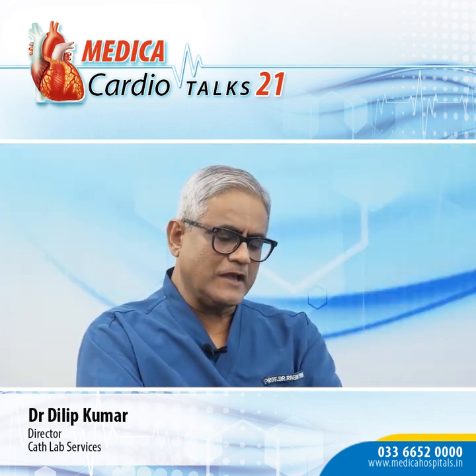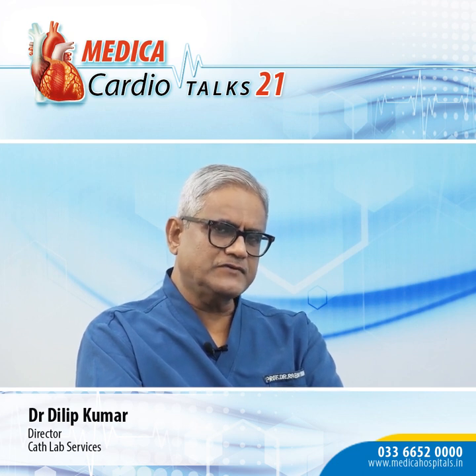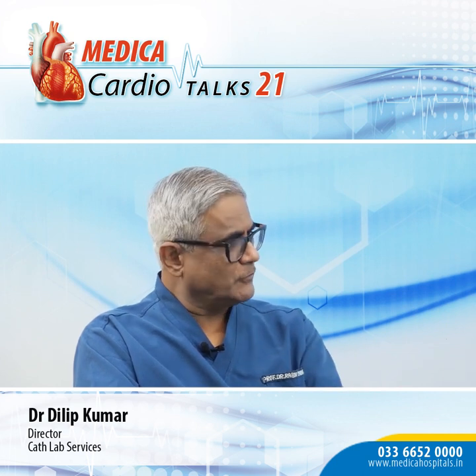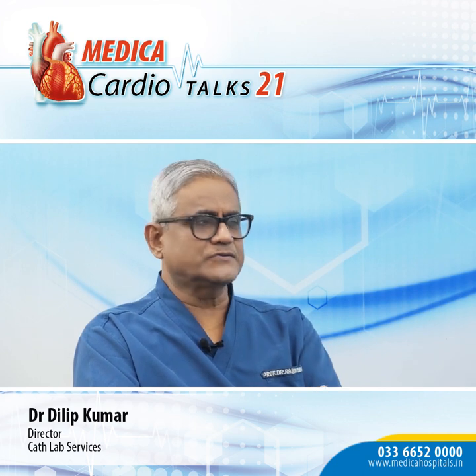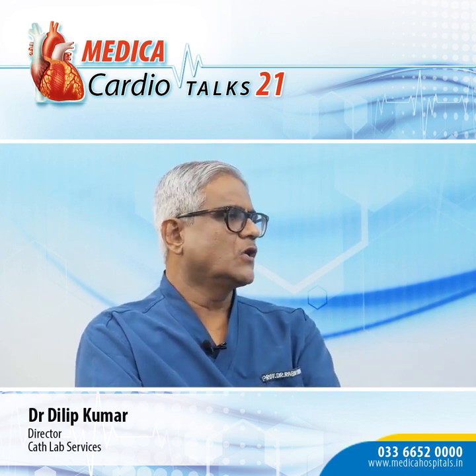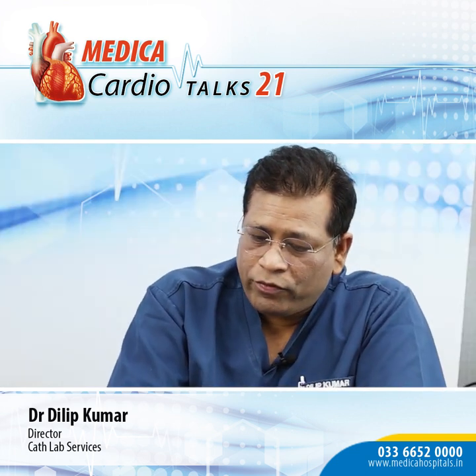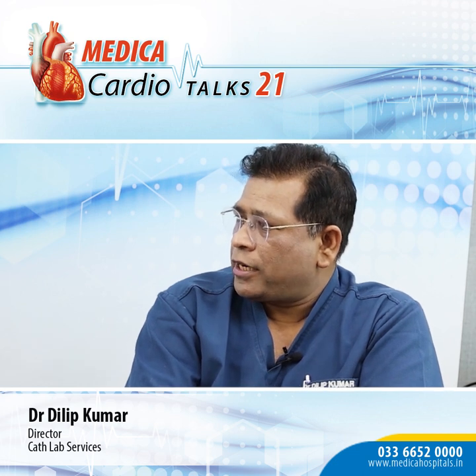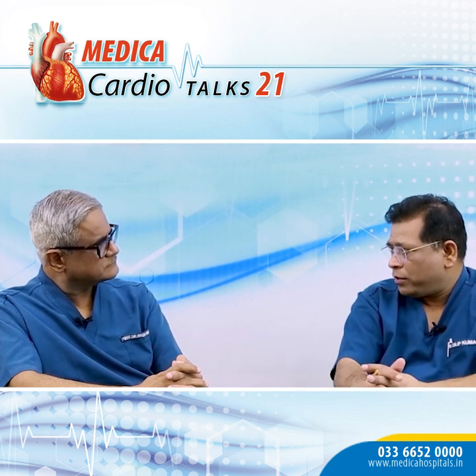Out of these 4 or 5 options of doing tricuspid valve repair in a transcatheter manner, which one do you think may be an acceptable one? The one people are practicing most, and for which the literature has maximum evidence of superiority, is transcatheter tricuspid repair. As of now, we have a very clear-cut idea that the winner is edge-to-edge repair, which is TriClip. The initial experience was with the same mitral clip devices.